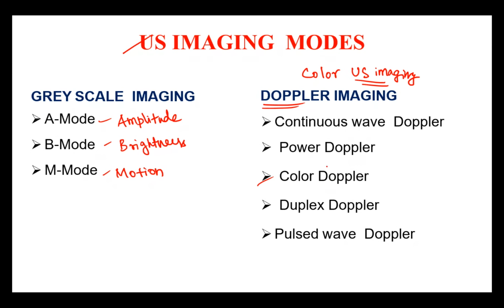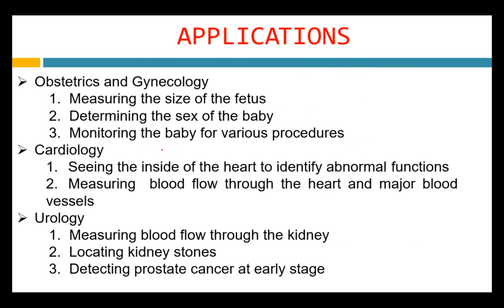Okay, so you will definitely come across all those in your theory part, but for GATE it's not that necessary, but you should know at least what A mode, B mode, M mode are. The applications are also not for GATE. Apart from GATE, you should know the applications of ultrasound. There are very few applications, and all of you may be aware of them.